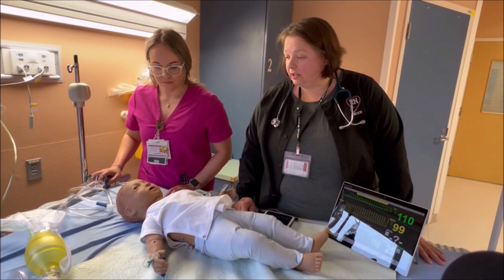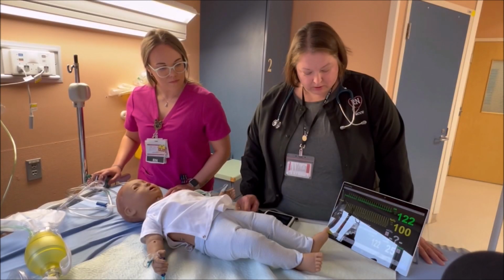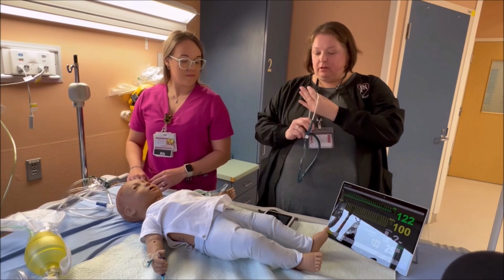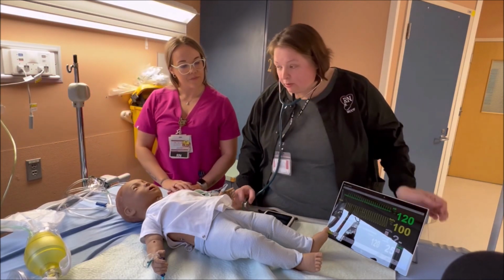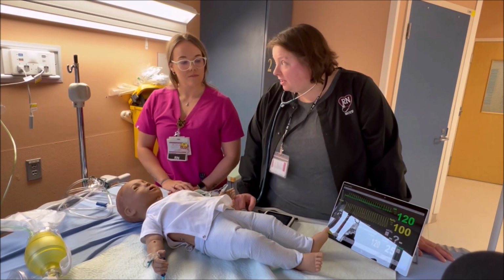Starting to blink a little bit. He's a bit more reactive, so that's good. Blood pressure is looking better, definitely better. We'll check his cap refill and other perfusion symptoms to make sure that he's doing okay in that way as well. And we probably want to make sure that we have some medication ready to give if it happens again.